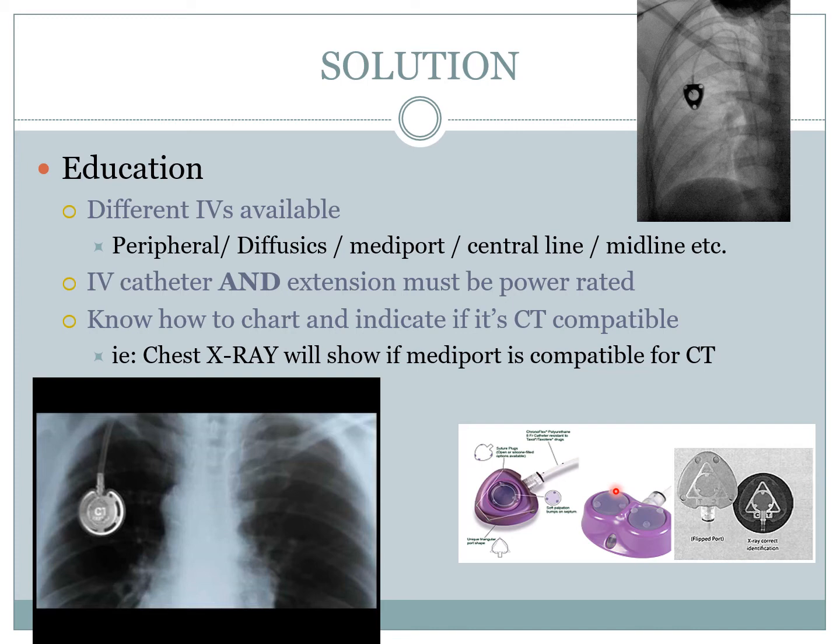Because sometimes, I mean, we all make mistakes. Sometimes we chart it incorrectly. And, you know, we try our best not to, but sometimes we do get busy, and it's understandable. But a way to completely confirm is to actually go through that image and look at it.